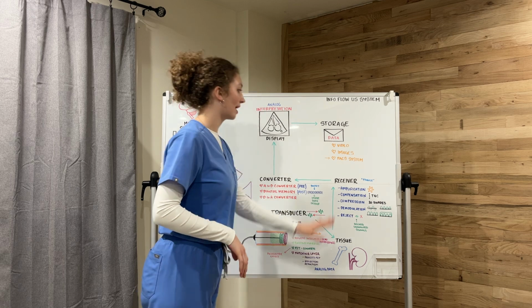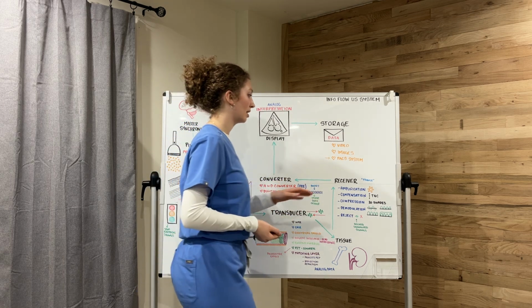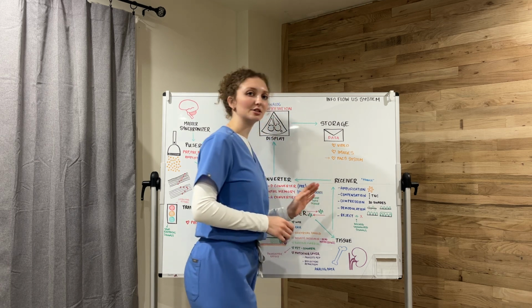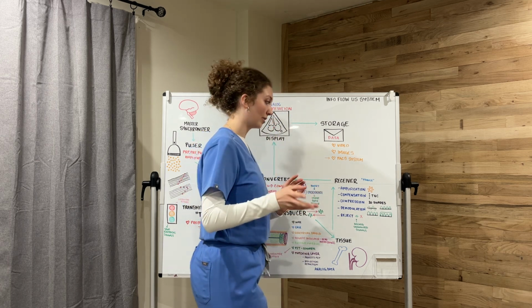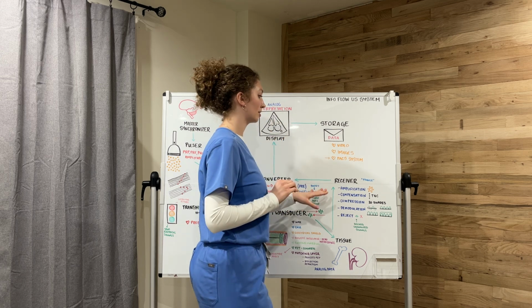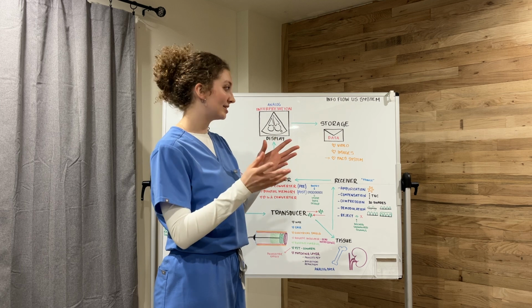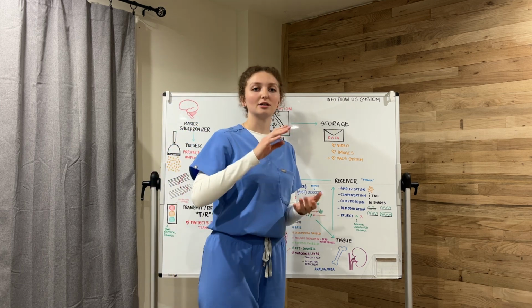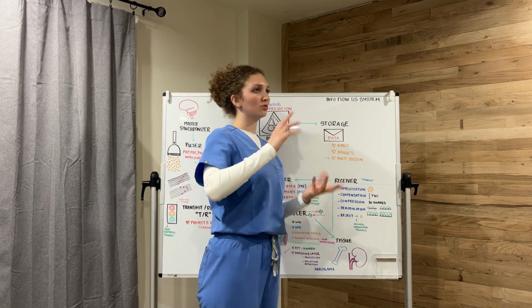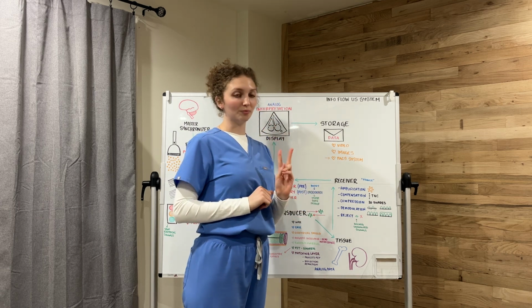From the tissue, we have the receiver, which you can think of as the editor of the machine. It has a few parts: amplification, which is overall brightness. Compensation is uniform brightness. Compression reduces the signal range, and it also reduces the shades of gray to around 20 for human detection. And then demodulation has two parts.